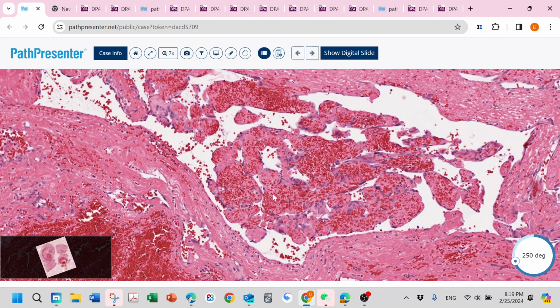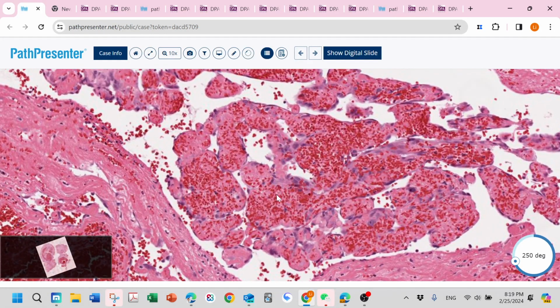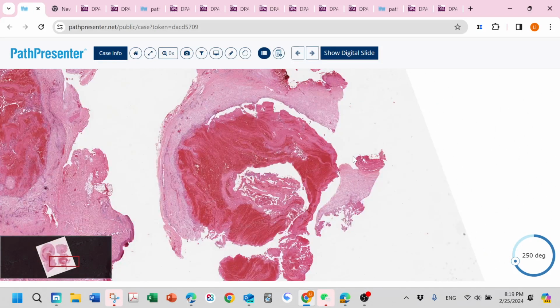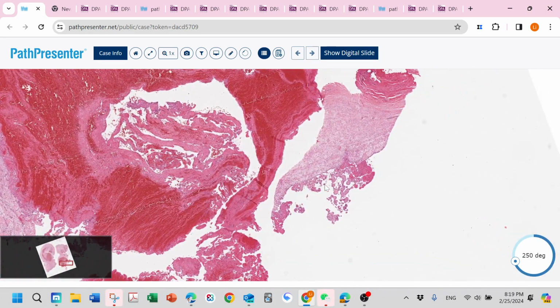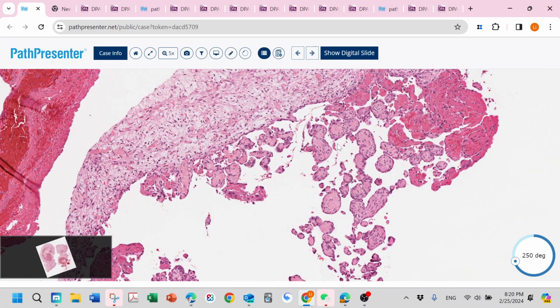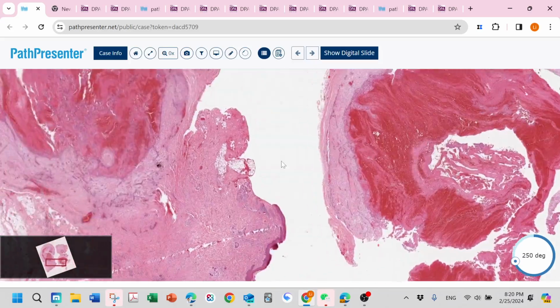structure, but this is truly benign because you can see all the endothelial cell proliferation is just bland looking endothelial cells. And then a good feature is that you see a big dilated vessel, and all of these papillary structures just grow inside. They don't have an infiltrative border, so that's a really good sign for this papillary endothelial hyperplasia, Masson tumor. See this papillary structure, but it's just recanalization of a big thrombus in a big vessel.